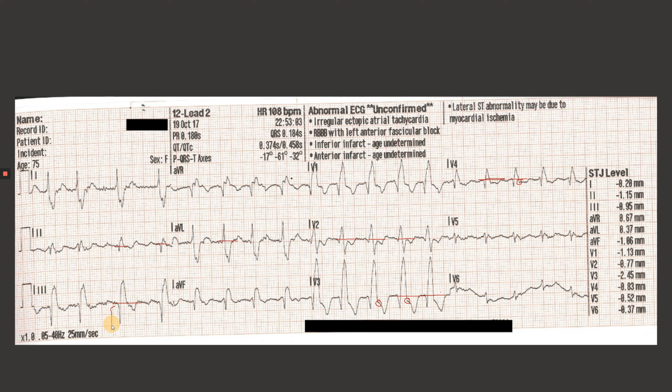I do have a pathological Q wave here. It's bigger and taller. It's more than one block wide and more than a block tall. And I've got one here and probably right here, right there. It's a little tough to see, but with all that considered, this is not going to be counted as a STEMI. Okay. There are some things to look at.